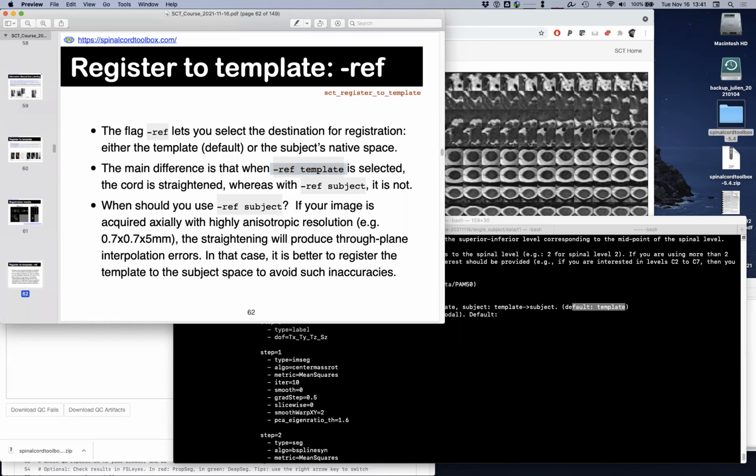So just to understand a little bit the nature of this transformation. Is this transformation somehow symmetric? Like, is it invertible in a way that if you switch template and subject, or if you invert the transformation, you're going to get the same results? Yeah, that's a great question. And related to that question, are these transformations diffeomorphic? They are diffeomorphic. Exactly. Okay. So that answers your question.